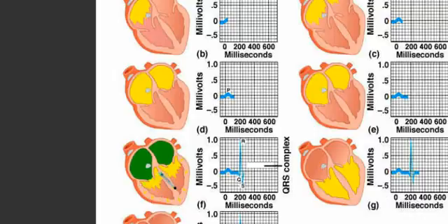And remember, I mentioned earlier that depolarization happens from the left side of the septum and diffuses outwards accordingly through the Purkinje fibers. But what we do not see is repolarization of the atrium. That is sort of masked by this large dramatic change that is measured in voltage from the ventricles firing.